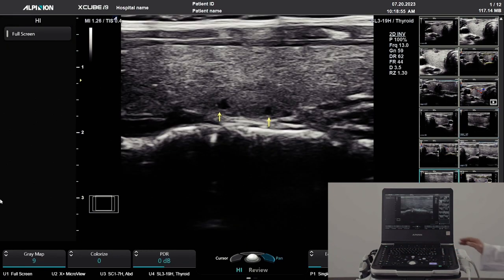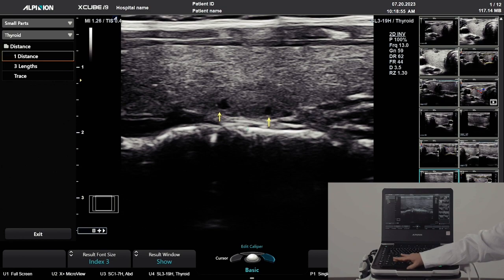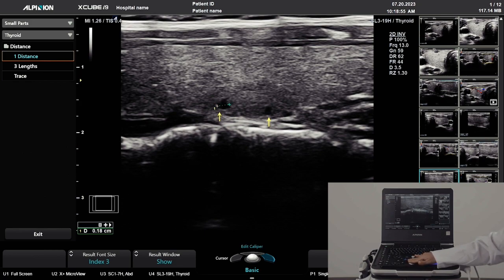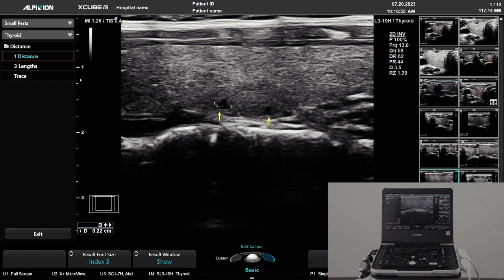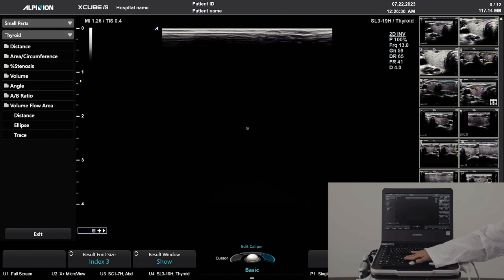With the caliper key, you can do a generic measurement. To measure an area, press the caliper once again.